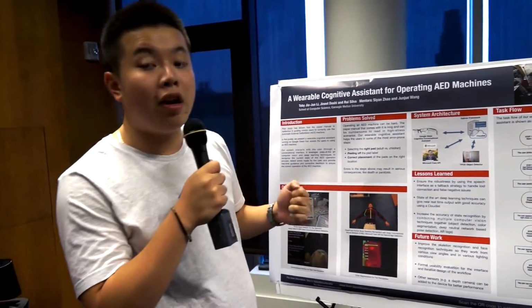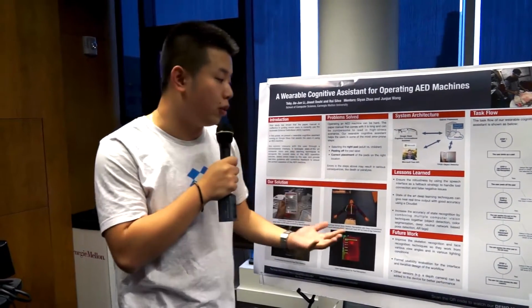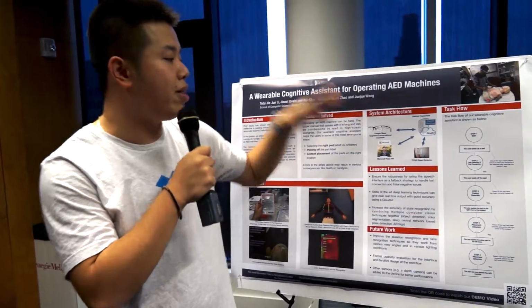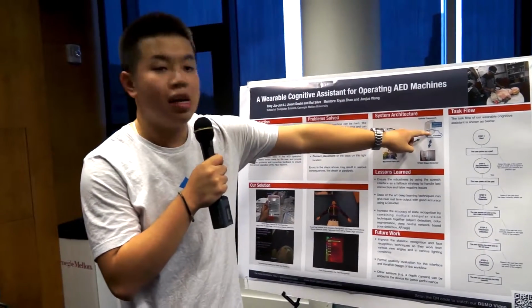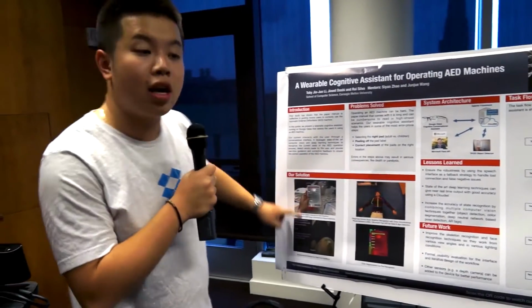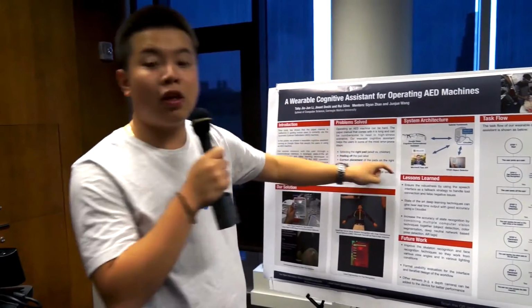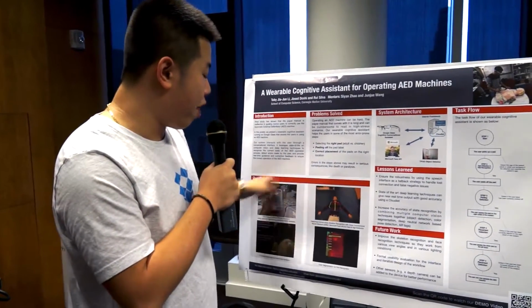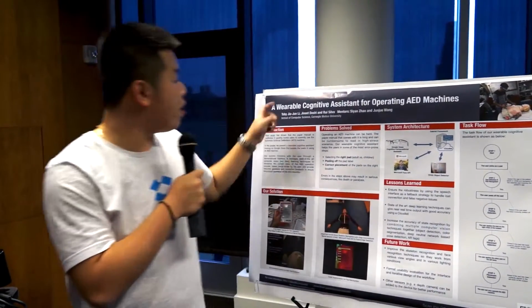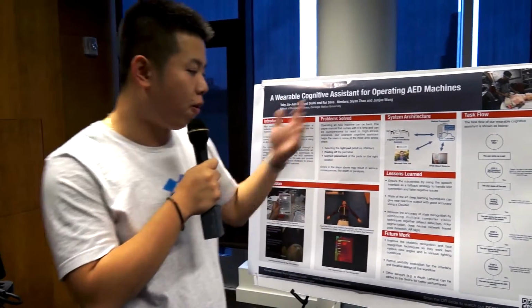Second, we learned that state-of-the-art deep learning techniques can give us near real-time output using a cloudlet. Because the idea of the cloudlet is it runs at the edge of the internet, so it has low latency to the Google Glass. And because all our computer vision algorithms are highly efficient, we can process all of them very quickly, and we can give the feedback to the client in real time. Because operating an AED machine is a very time-critical task, so having low latency is very important here.